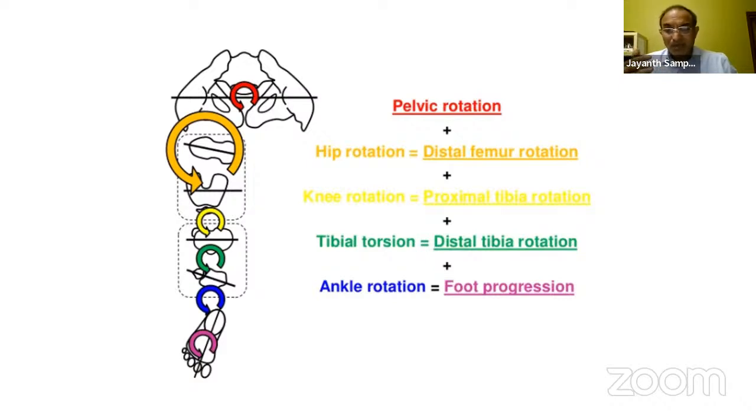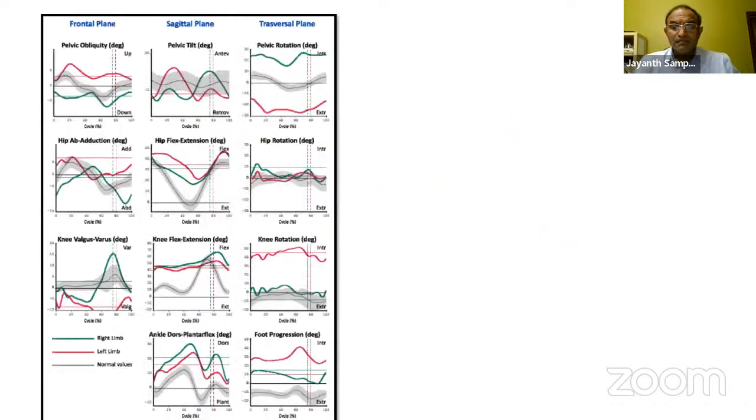And that's very important when you want to correlate gait findings with clinical exam findings and video findings, because we make a lot of important surgical decisions, whether to do a femoral derotational osteotomy or a tibial derotational osteotomy or some kind of foot correction surgery. Knowing how exactly the particular gait analysis system the company has represented the transverse plane is extremely important.